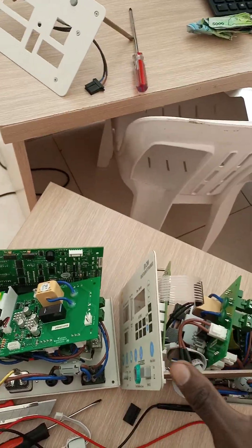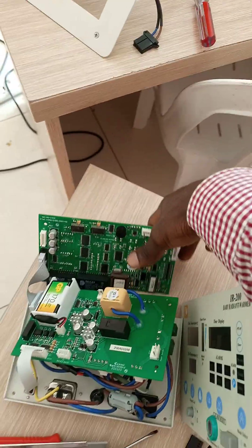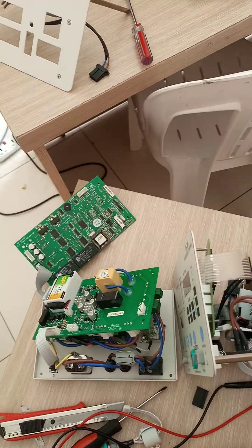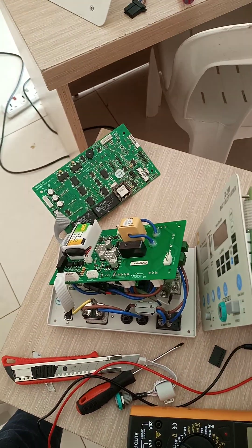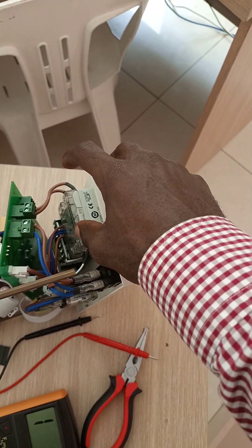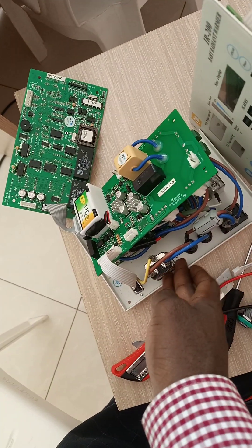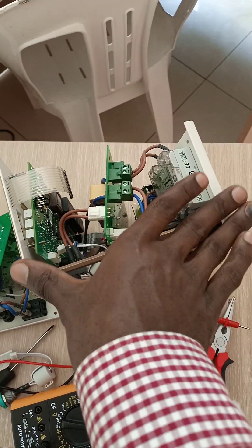I have two control boards here. One came from a fully functional machine and one from the faulty one. I used the functional board to troubleshoot. I started with the power board — I swapped the power board from the functional machine into the malfunctioning one, and the functional machine still worked while the non-functional one still didn't.